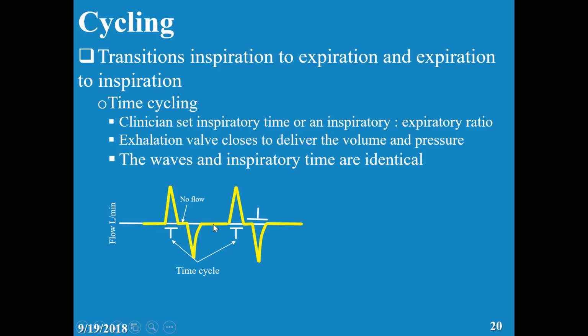When the baby needs sedation, he will start not breathing well, he starts moving. Once the baby is unsedated, and then the nurse comes and tells you, okay, doctor, the baby needs more sedation, he's not okay, and the baby is ventilated, and you come and you see the pause. Probably you need to decrease this pause, and if the baby starts to be comfortable, then this is the appropriate pause for him or her. I didn't hear you very well, so I don't know if I answered the question. Okay, that's great.